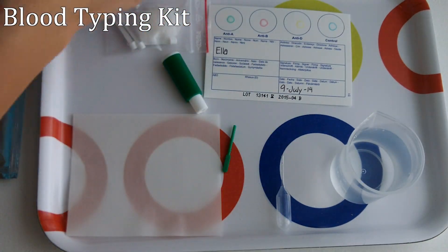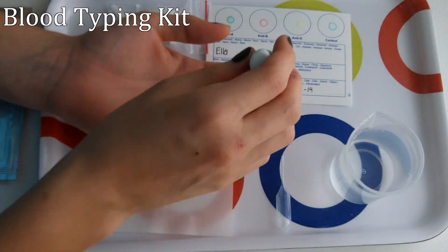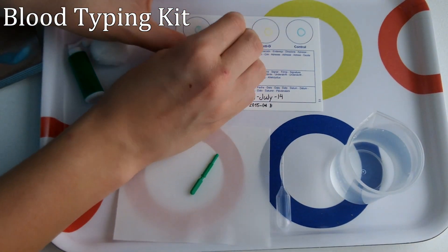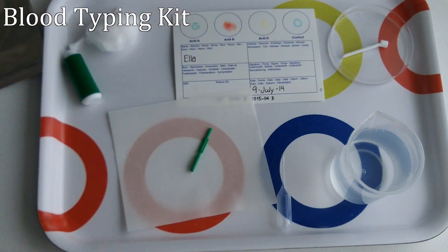I cleaned my fingertip, then used a lancet to draw blood. I collected samples of my blood on the four Eldon sticks provided, then placed the blood into the center of the colored circles.